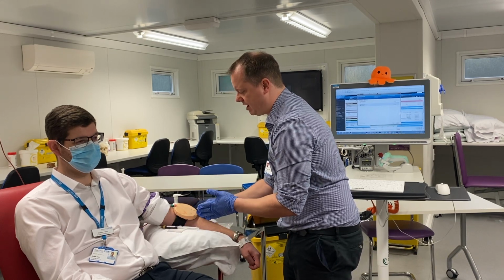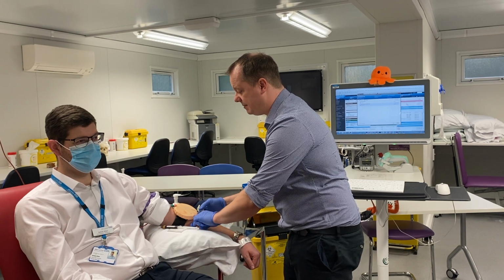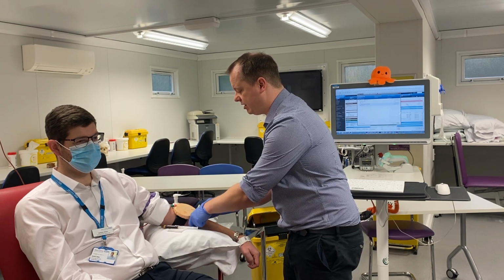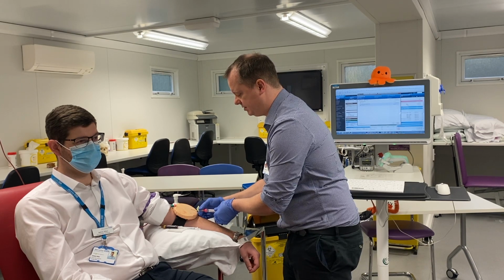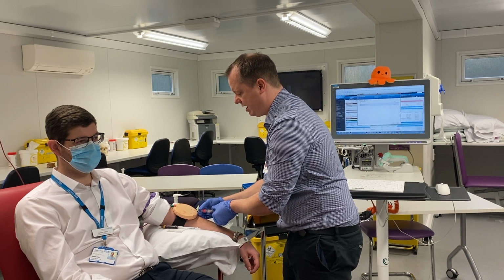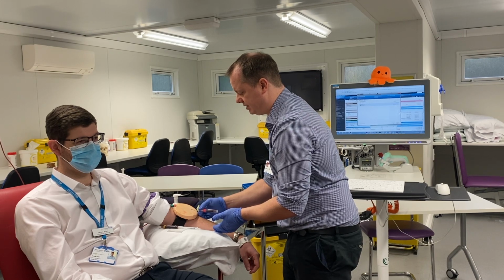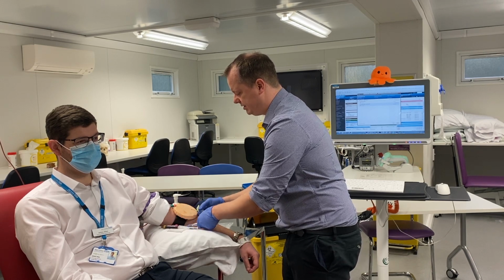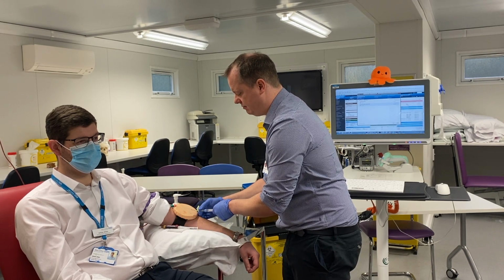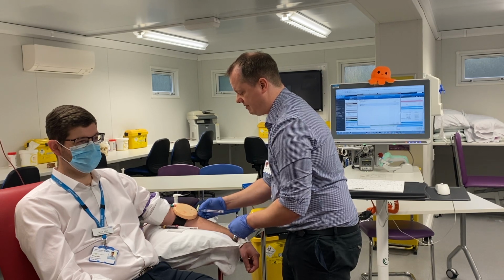So if I'm doing a brown, a red and a blue, if I think about my tree, the thing that comes after the trunk would be green leaves, then the fruit, so that's what I'm going to put on now. So I'm going to connect that bottle, and because I've pre-vacuumed, that automatically fills up. And then obviously the last bottle is the blue one. I'm going to connect that on, allow that to fill.